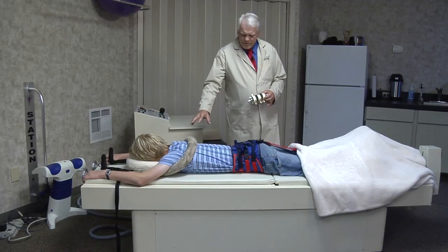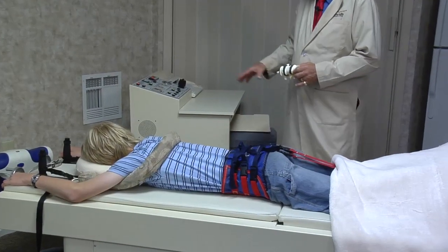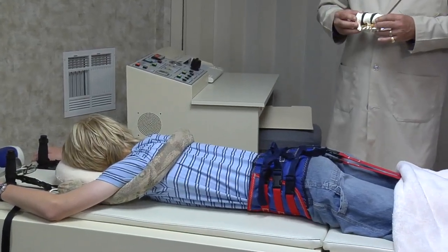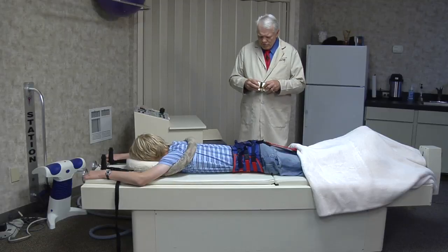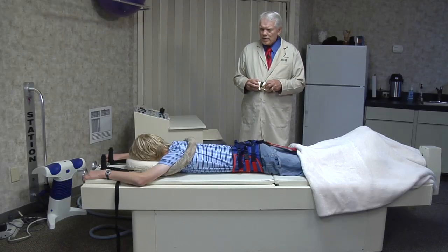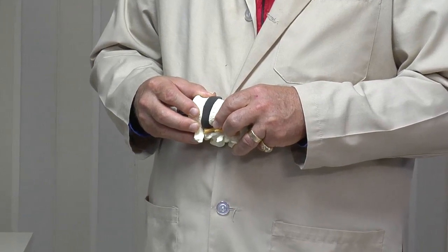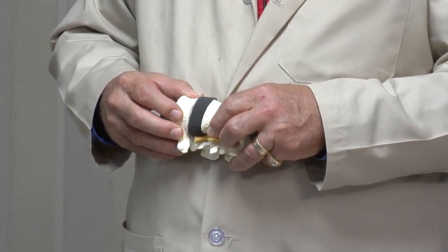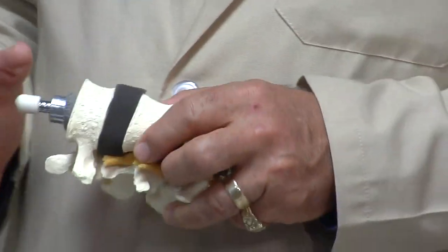One of the most sophisticated forms of technology for spinal decompression is using a VAX-D decompression system. What this basically does is we stabilize the upper dorsal and we stabilize the lumbar spine. Through a computerized traction, the machine decompresses the discs in the spine. It pulls the discs apart and holds for one minute, then slowly releases for one minute, then pulls a little further and holds again — repeating that cycle for a full half hour.